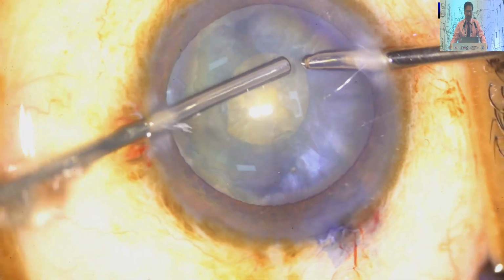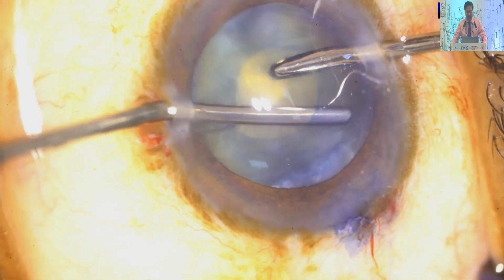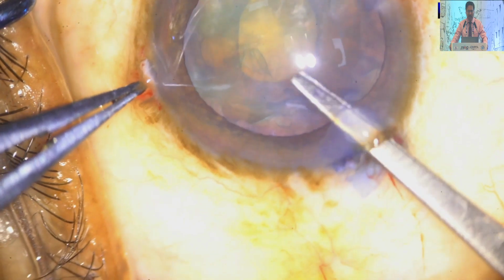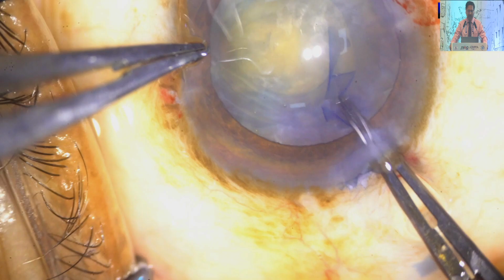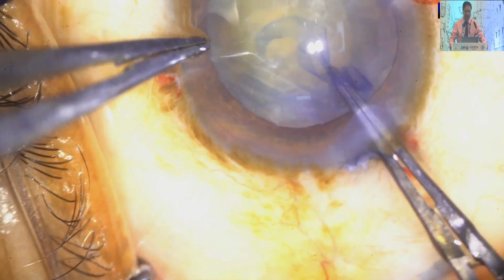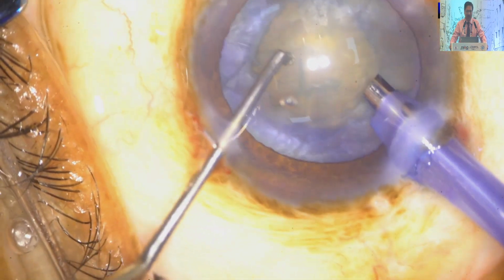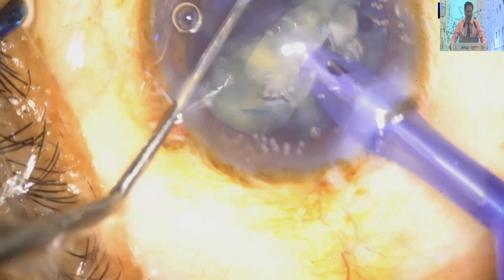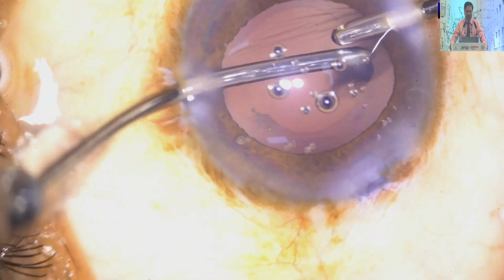And now this is the first CCC, a small CCC I have made. Then I will enlarge it later on. I am taking out all the cortical matter from the capsular bag, where there is a high intracapsular pressure in intumescent cataract. So we have to decompress it, debulk it, and then we can perform the nucleotomy and other phacoemulsification techniques as usual. So many times you encounter a hard nucleus, sometimes you encounter a soft nucleus in intumescent cataract.